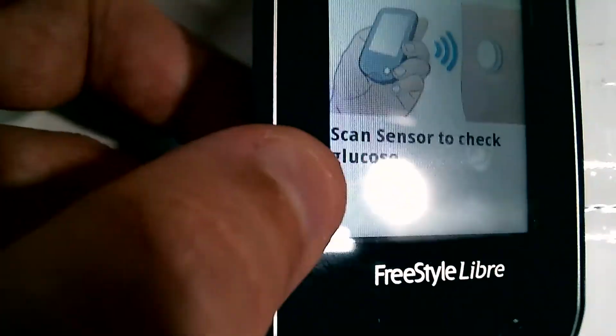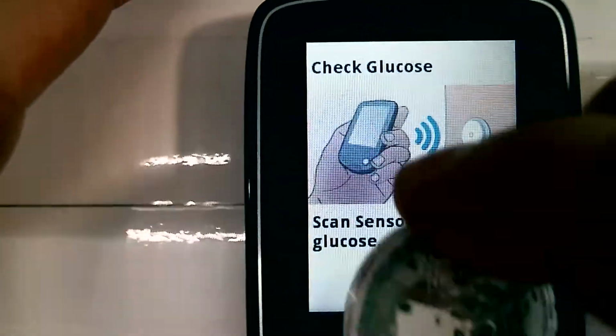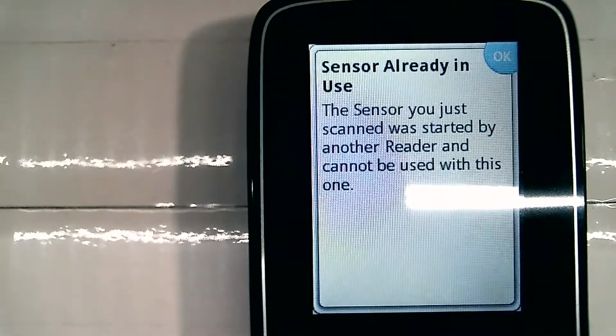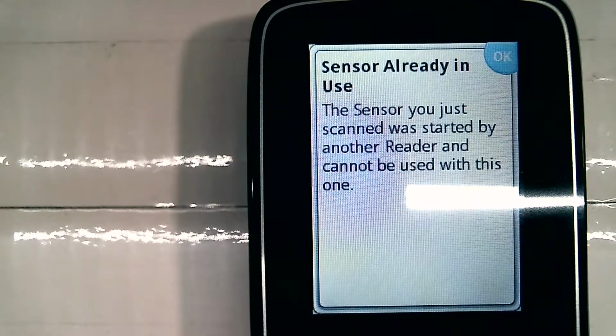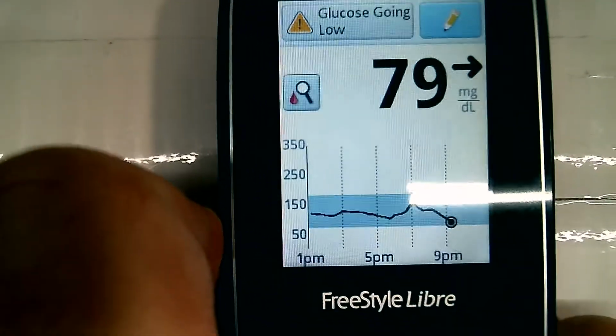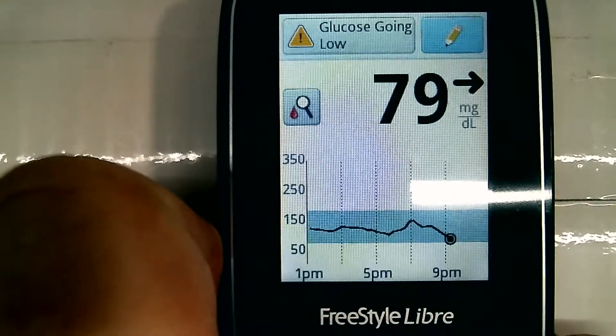So here's the actual meter that goes with it. Pretty much just get this close to it. Obviously, it's not too happy about that since that sensor can't be used anymore. But you actually can use it on a sensor that actually works. It's actually on you. And it does properly measure blood glucose. So that's all fine and good.